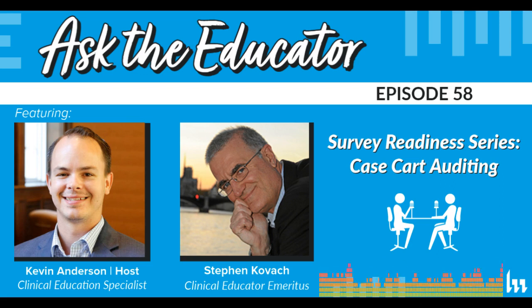We didn't even talk about endo. Some people are doing scopes, and are they being returned properly? I mean, this can be whatever's returned to your department, but you've got to engage your customers, and they've got to be part of the audit and why it's being used. Like you said, not punitively.